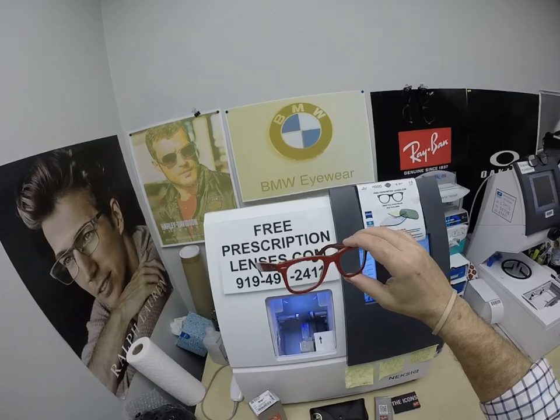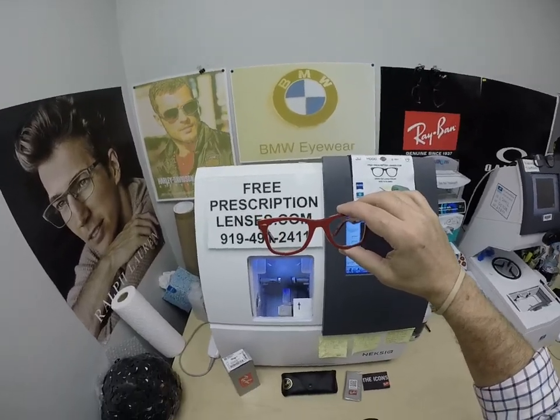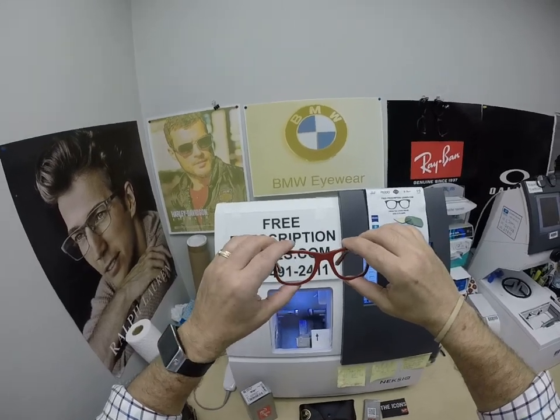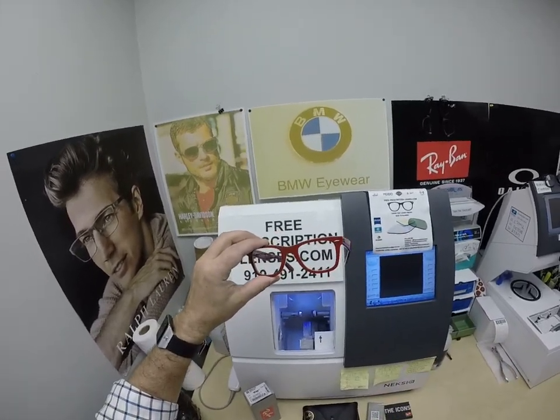The red front, and this one he got the Zeiss Photofusion Green with anti-glare. The first one was the Photofusion Blue with anti-glare, now the green. And you'll see another video of his soon — later this week he's going to have a Versace with the Photofusion Extra Gray and the gold flash mirror.